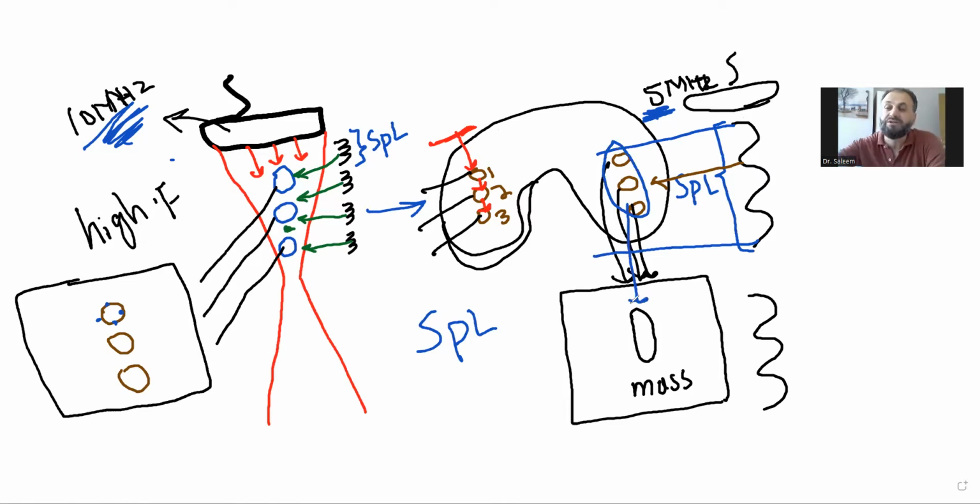Now, if I send this information to my surgeon, maybe this patient needs surgery next, most probably my report is mistaken. I said there is a mass, which is correct, but saying it's one mass is wrong. There are 3 masses, and I just gave them one mass with a measurement, anteriorly and posteriorly, or superior and inferior, and side to side. If I give them this information, it is a mistake. It's not correct. So now I'm sure you understand the difference and where to use which probe.